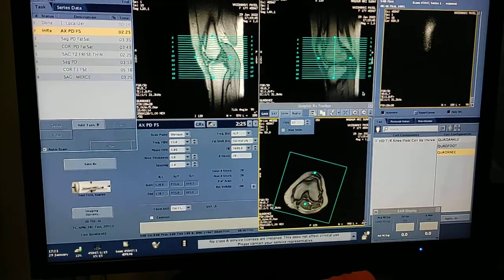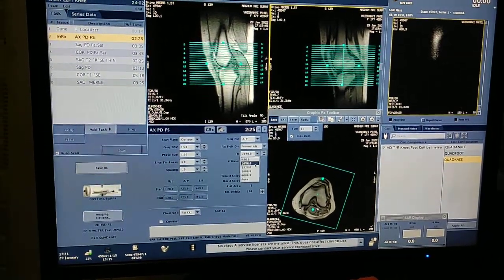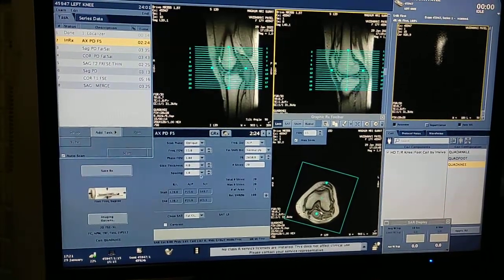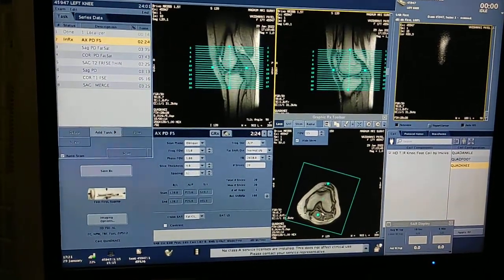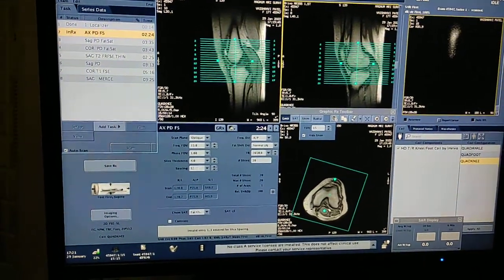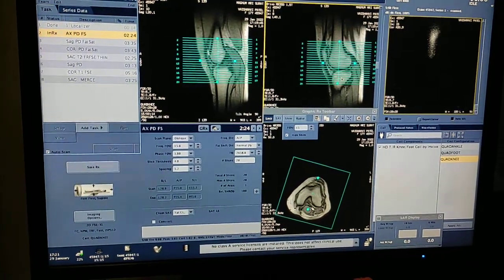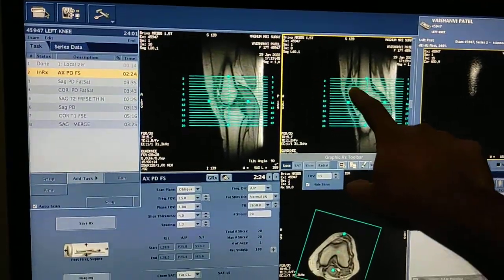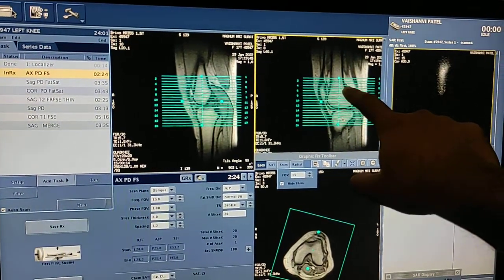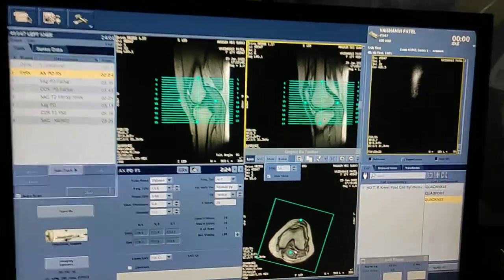I am taking axial FS PD with 4 mm thickness and spacing of 1. I am giving angulation in the axial box to get a good true axial image, and slightly increasing the spacing to 1.2. Coverage starts from the patella, so you have to take one extra image — from the patella down to the tibia and fibula.